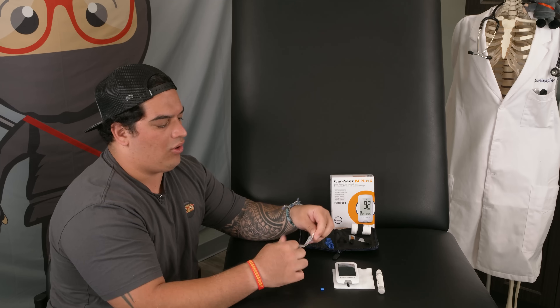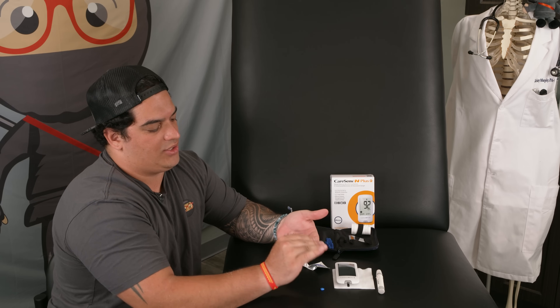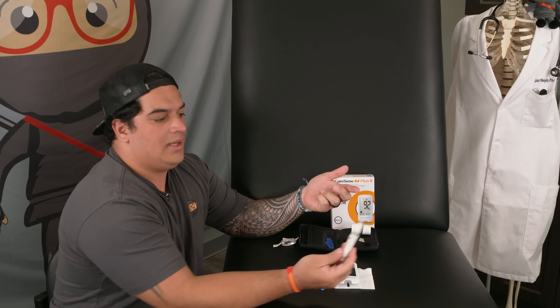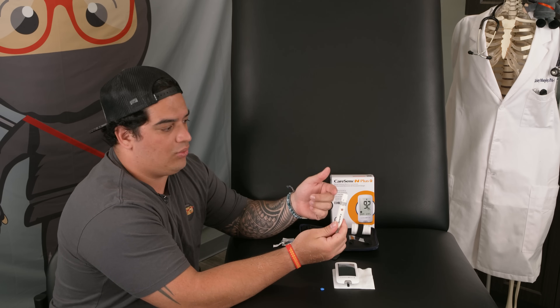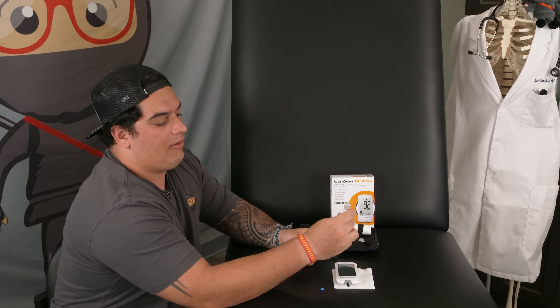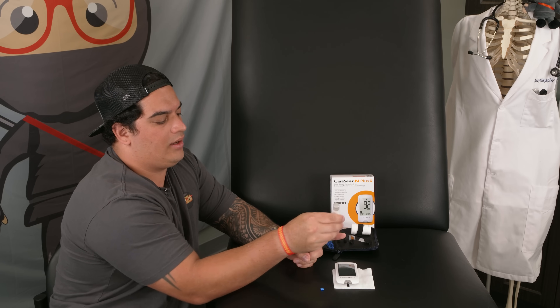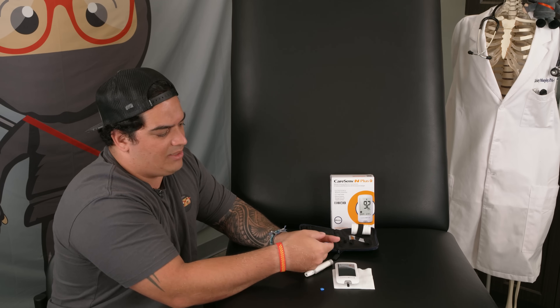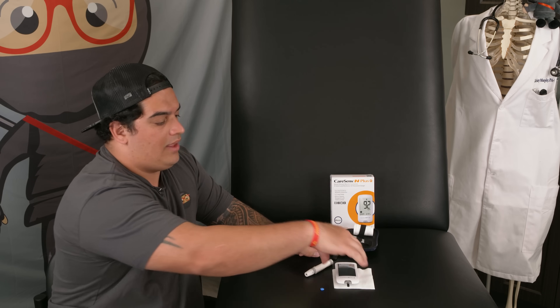I'm going to take an alcohol prep pad and clean the finger I'm going to use. After cleaning up, I'll take the lancet device — it's set to five and the trigger is ready. I like to use the edge of the finger for the prick. One important thing: you don't have to squeeze a lot, because squeezing too hard can introduce interstitial fluid. Just give it a gentle little push.